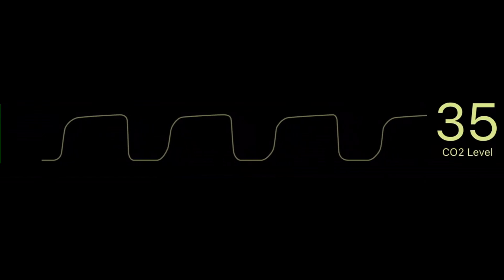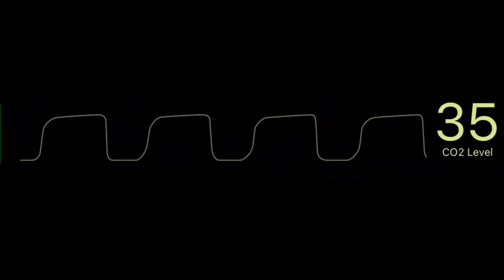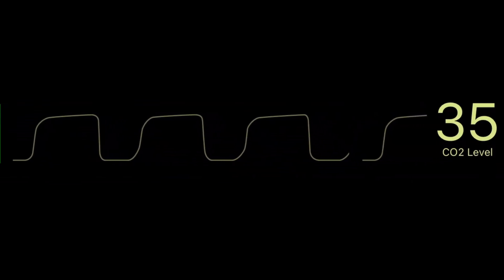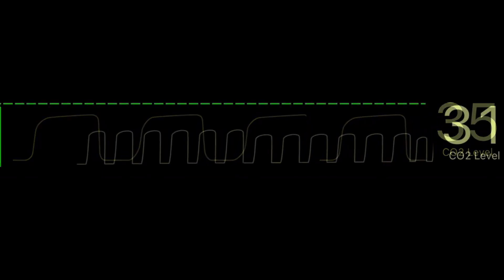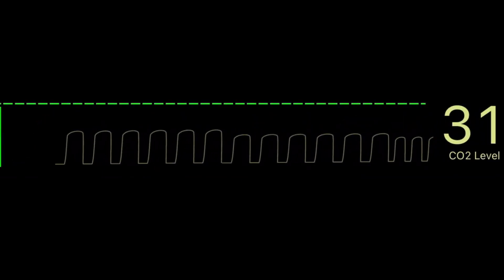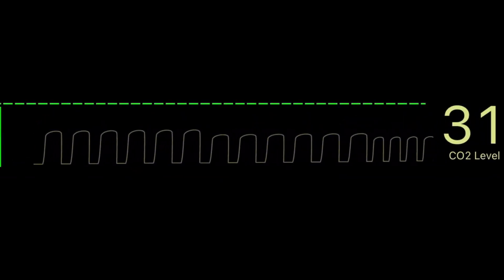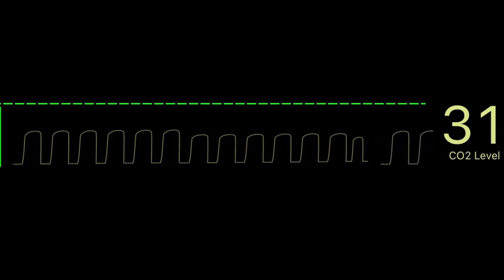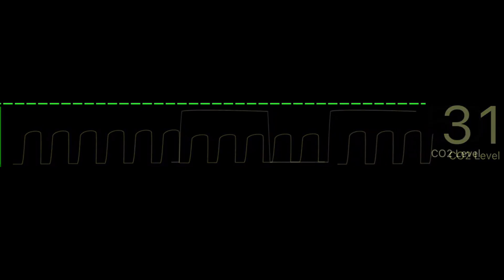A normal capnography reading will have a normal-looking waveform and plateau, with a numeric reading of 35 to 45. Patients who are hyperventilating are going to have waveforms that are smaller and closer together, and they'll also have a lower CO2 reading.